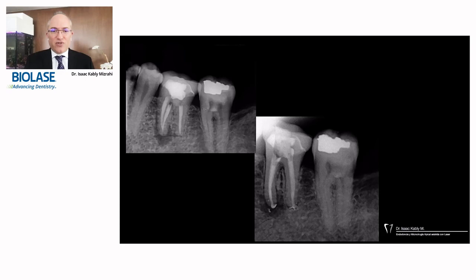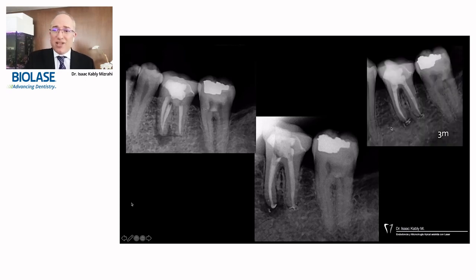And again, this is the immediate x-ray after I finished the root canal, and after 3 months I was expecting to see some bone healing around. So you can see here this lesion is getting really short after 3 months. It's the laser energy that was transmitted through the dentin to the bone, and this laser energy induced the alkaline phosphatase to do its work, the bone to heal, the ATP to create more energy in the surrounding cells, and microcirculation optimization of that zone that brings the healing.